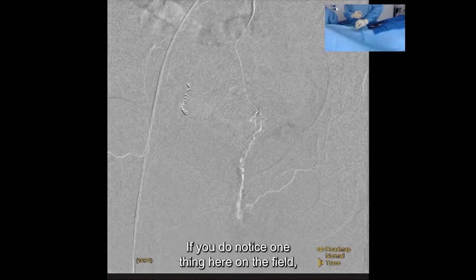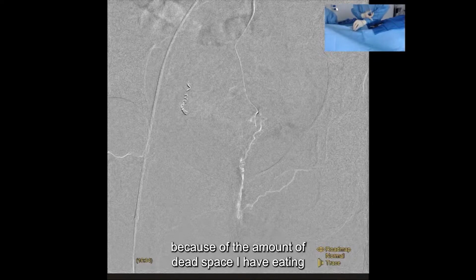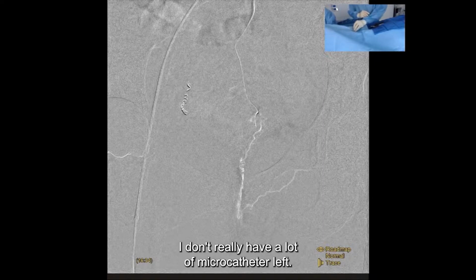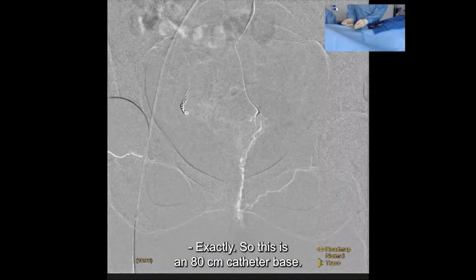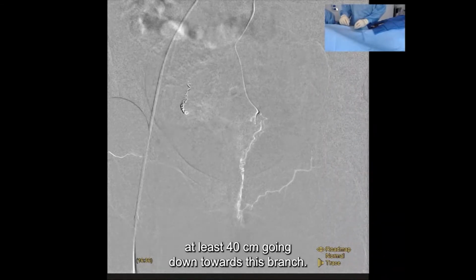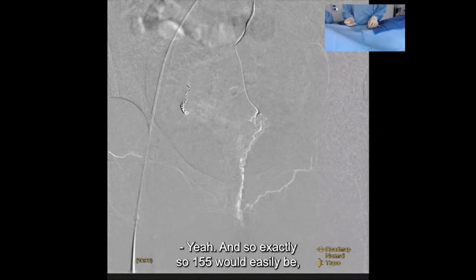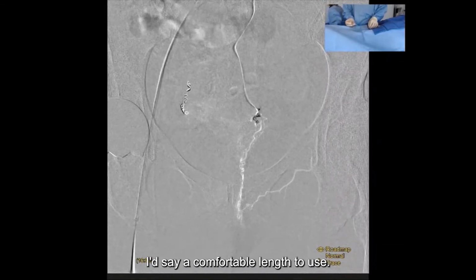If you do notice one thing here on the field, one thing you find interesting is that despite having this catheter, because of the amount of dead space eating up my base catheter, I don't really have a lot of microcatheter left. So what length? That's basically based on the length of your base. Exactly. So this is an 80 cm base catheter. With that 80 cm, I'm now going at least another 40 cm down towards this branch. And this is a 130 TruSelect. So 155 would easily be, I'd say, a comfortable length to use.